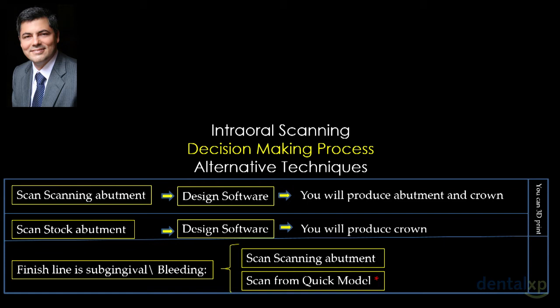I have a friend in Taiwan, and he went ahead and he bought an intraoral scanner. He took it into Taiwan, but there were no digital labs in Taiwan at the time, so the intraoral scanner was good for pretty much nothing. He couldn't use it to do his restorative dentistry. So what you have to understand, because we have people here from different countries and different places, is that in your area, the technology might not be there yet. So you might have to import the whole set of technology into your specific geographic area.